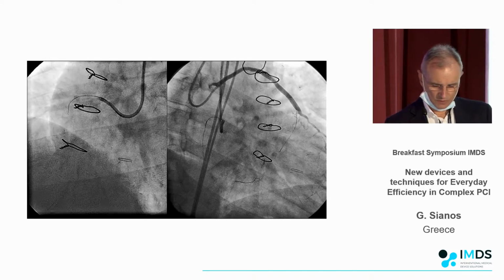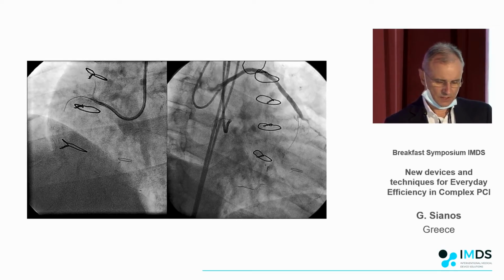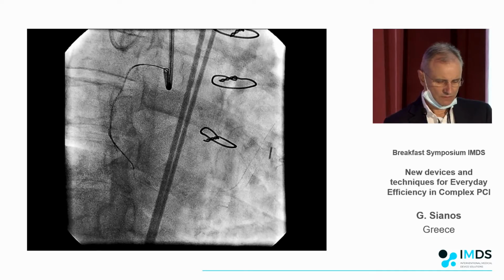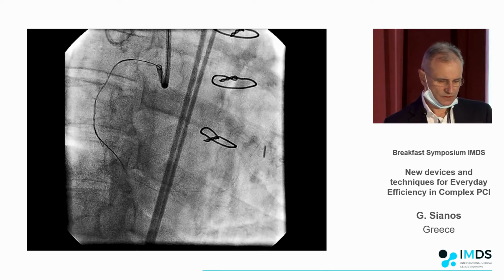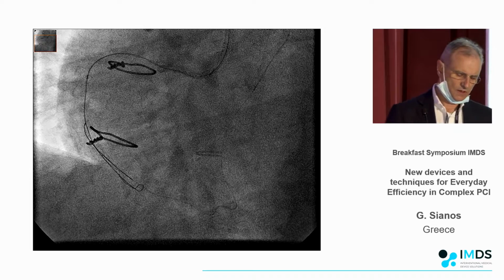In my last case, I'm going to present how we dealt with collaterals with this device, where microcatheters were failing. Anyway, you see a very good alignment here, and the wire is there, but the retrograde microcatheter is not crossing in this very calcified vessel. You can appreciate it from the shape of the wires. The wires were aligned, but everything else was failing. These are close-ups, so they don't work even on my computer because I don't have the capacity to interact with my screen.